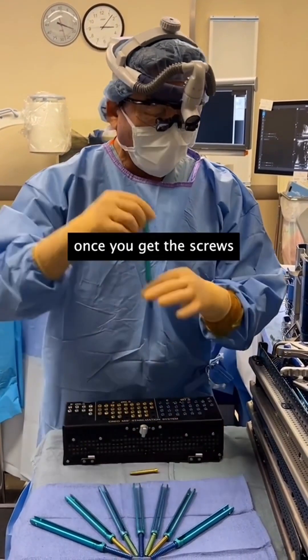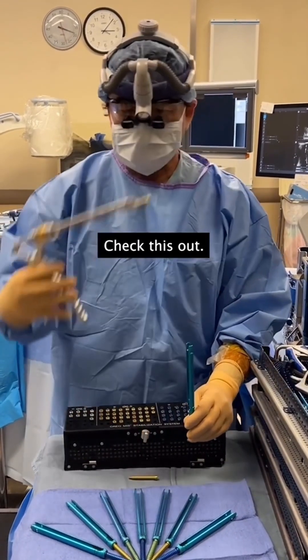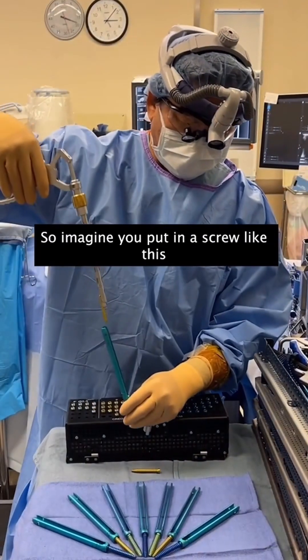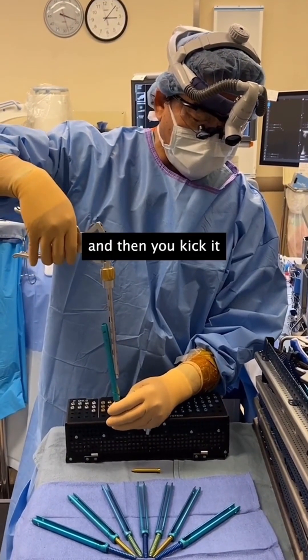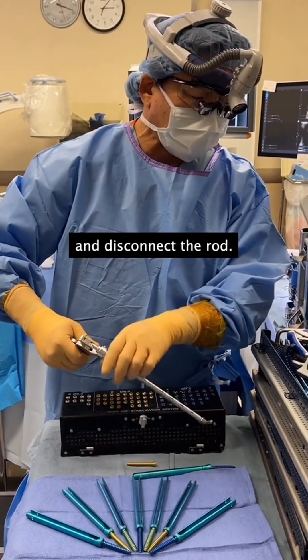You're probably wondering: once you get the screws in through those little poke holes, how do you connect them with the rod? So imagine you put in the screw like this, and then you kick it over to the next screw, and then you unscrew it right here and disconnect the rod.